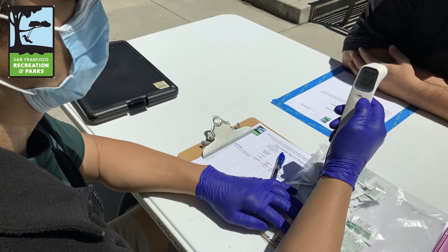Things to keep in mind when taking temperatures: sometimes you will get a low message on the temperature gauge. This doesn't mean that the batteries are low — it just means that you're not close enough to get an accurate reading.